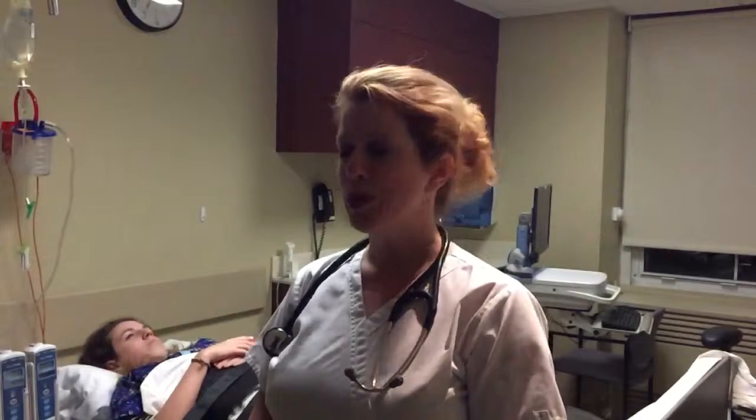Tilt table testing is a procedure done to rule out the causes of a syncopal episode. Syncope meaning loss of consciousness. There are several factors that might cause syncope. Some might be cardiovascular, such as heart block or sinus bradycardia or a slow heart rhythm. Some might be neurological, such as stroke or seizure. And others might be vasomotor, which is what tilt table testing rules out.